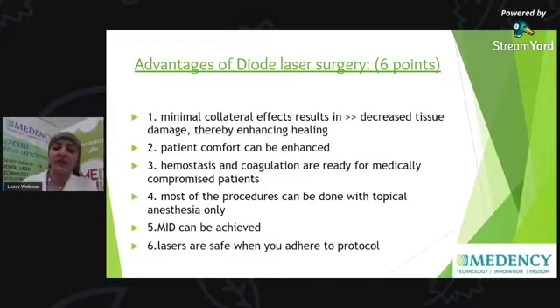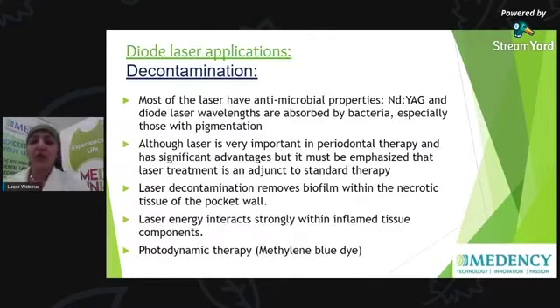Yes, if you understand the safety, how to use laser in a safe way, it's good for you and for your patients. Before going through the applications and beginning to explain the applications in detail, I want to agree with you on something, that we as dentists should keep in mind the target of the result we want to get in the dental clinic in this surgery or this application we are doing.